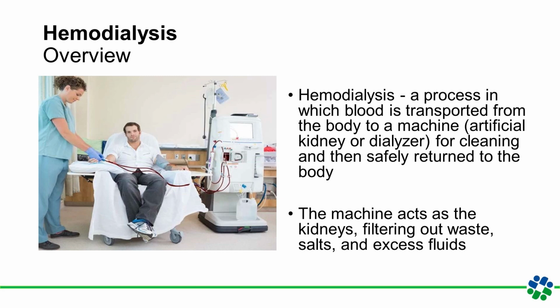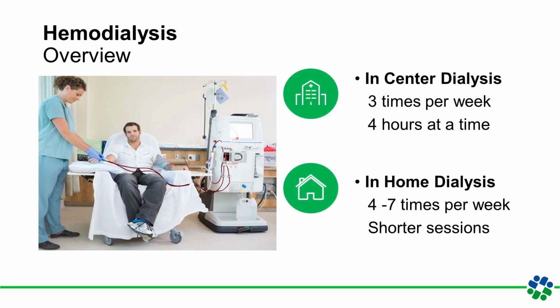Hemodialysis, therefore, is a vital bridge to health for those living with severe kidney disease. And this really illustrates, I think, the remarkable possibilities of modern medicine. Hemodialysis has a couple of options. We have in-center and at home. Hemodialysis can be administered in two primary settings.